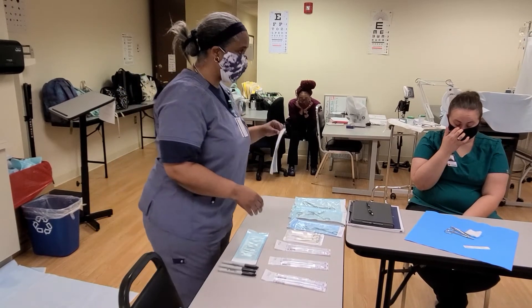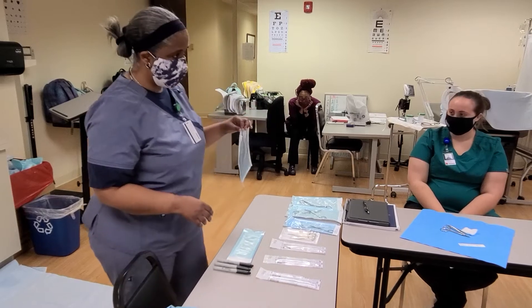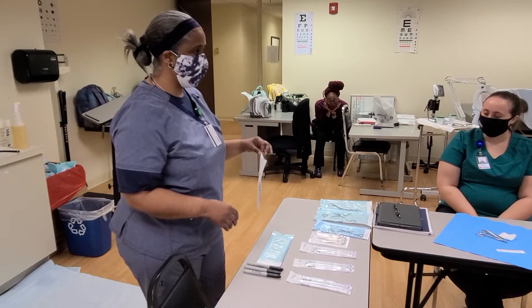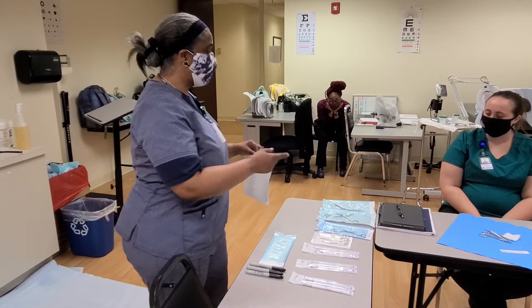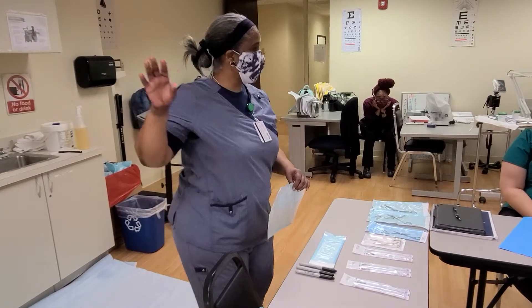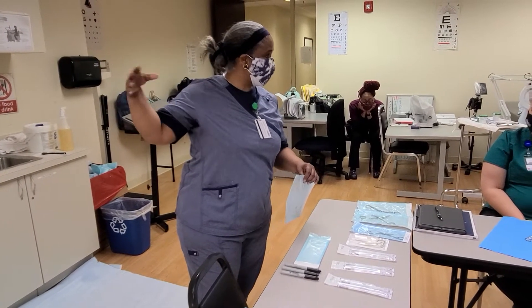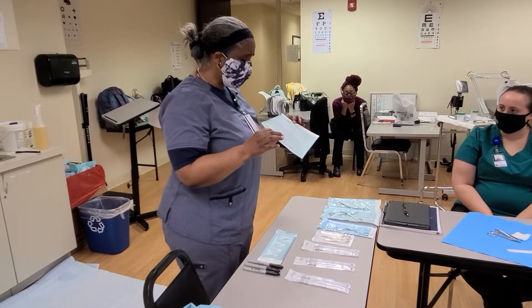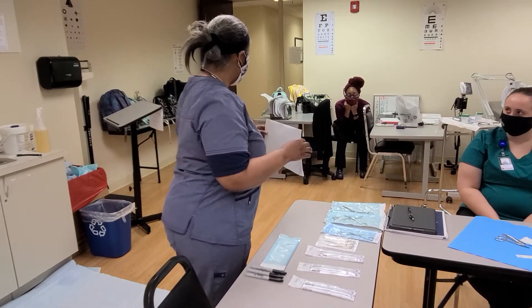This pouch has a shelf life of six months. It is important as a medical assistant that you know this, because it's your job when you come in — not only to do the eyewash — but you need to check your stock, rotating to make sure nothing's expired, and you also need to make sure that this doesn't have to be re-autoclaved.